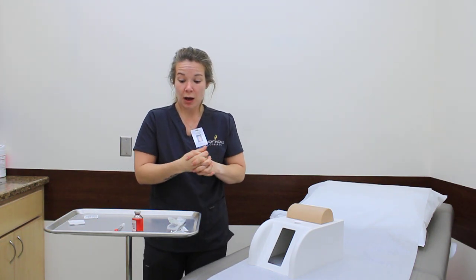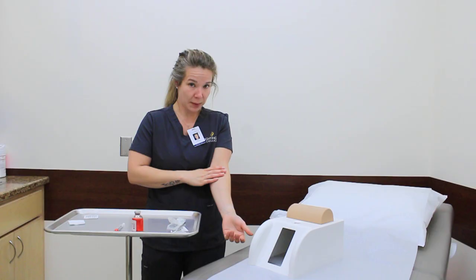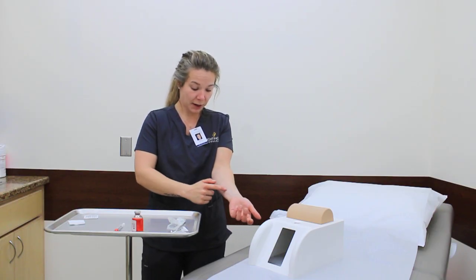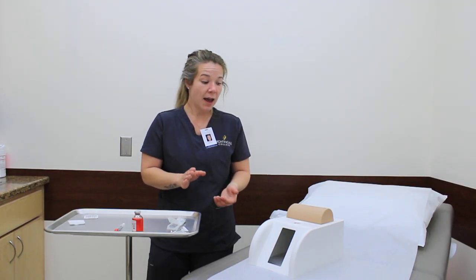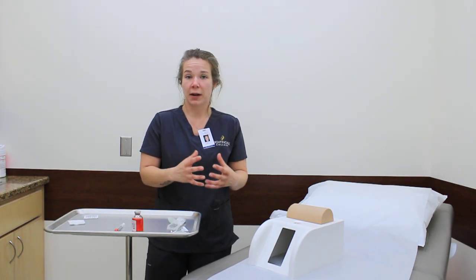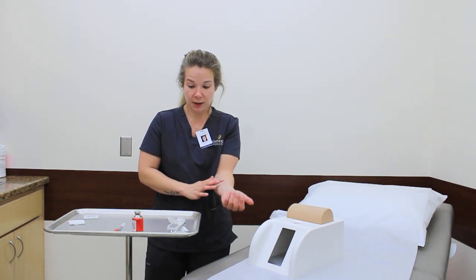So before I even prep, I need to locate my area, which is usually 3 to 4 fingers below the antecubital space, and then about 2 inches above the wrist. So it will be somewhere in this area here. And then you also want to confirm skin integrity, make sure that it is good, intact, no redness, splotches, any discoloration. And as long as everything looks good physically, you will then palpate to make sure that there's no tenderness or anything located underneath the skin. So again, I'm going to go ahead and pretend this is my forearm here, and we're going to inject the medication right here.